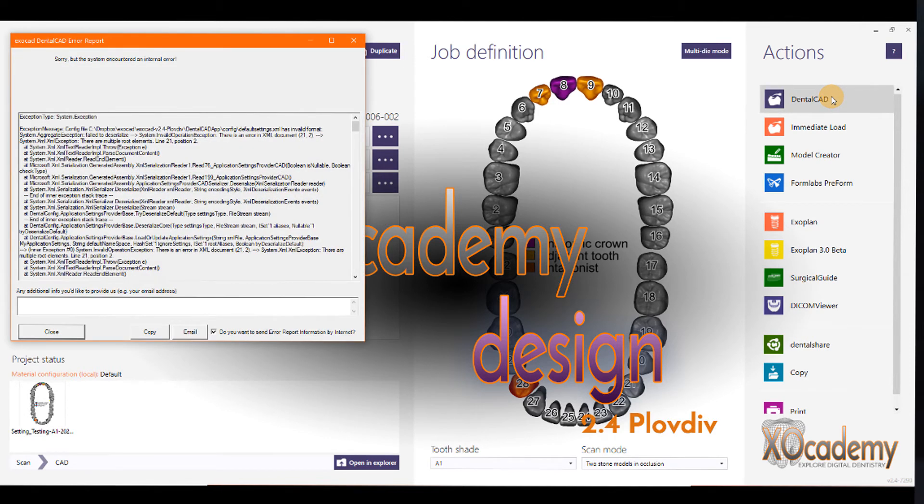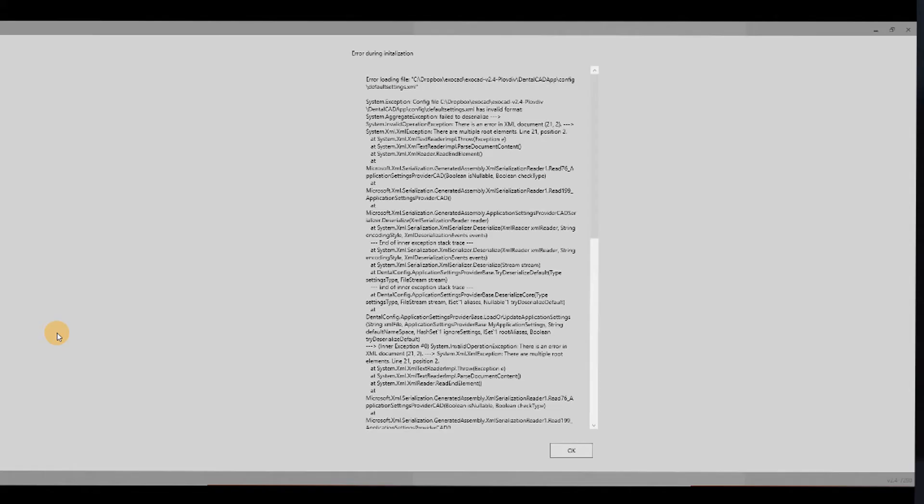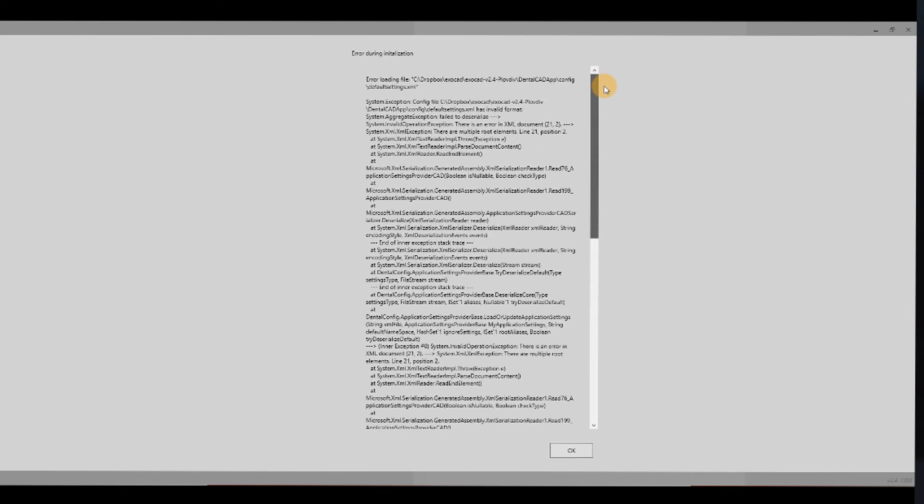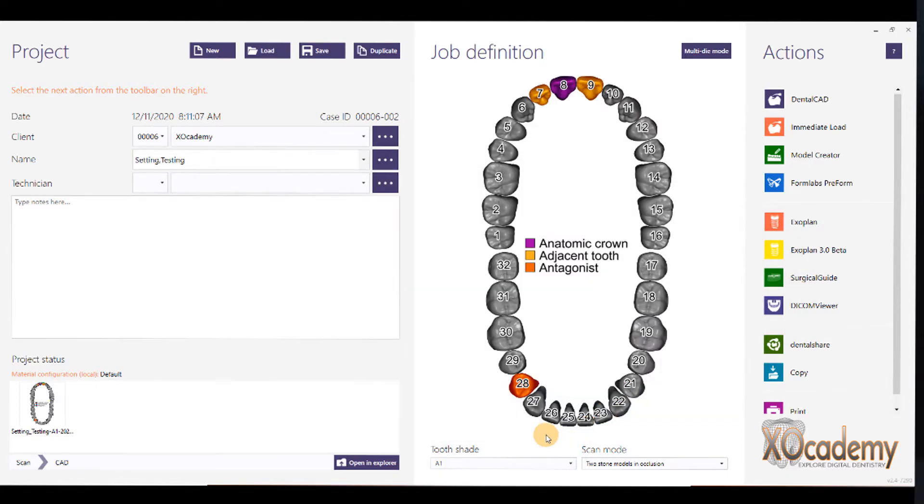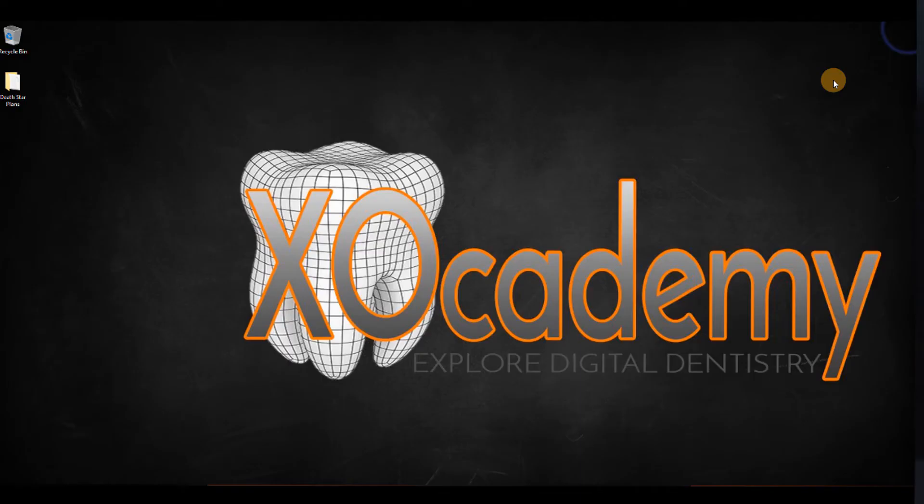So, we have an error here, an error report. And it says that the defaultsettings.xml has an invalid format. And error during initialization with a bunch of stuff that I don't know what it means, but we can see right here at the top, it's our defaultsettings.xml produced an error. And we can't even start DentalCAD. So, that's why you always want to make a backup, a backup just in case, so you can delete the new file and just save your backup as the original file. So, we're going to close this.